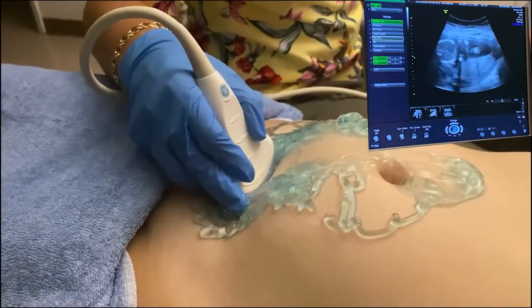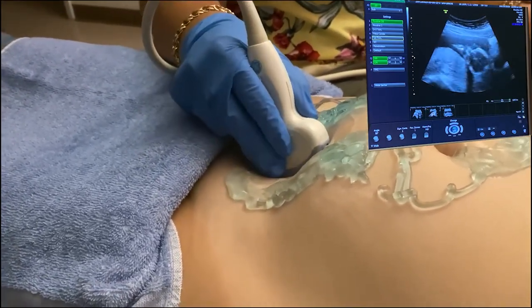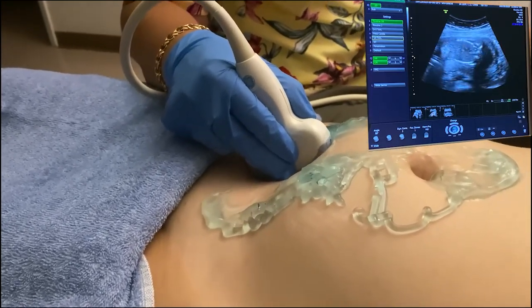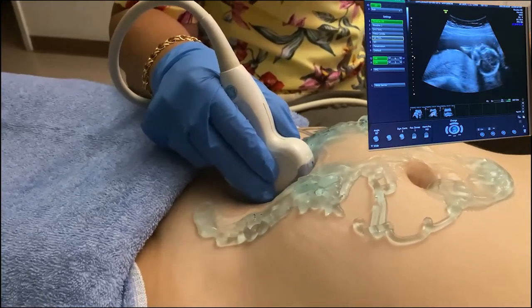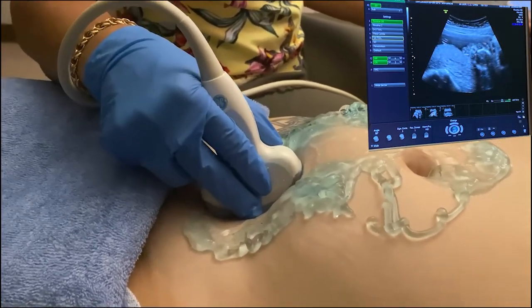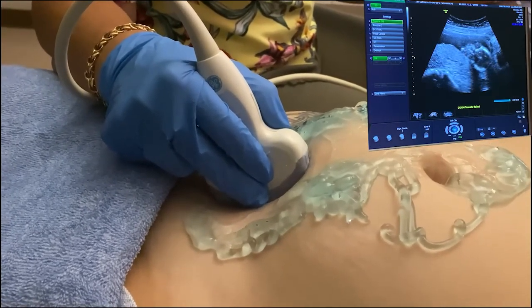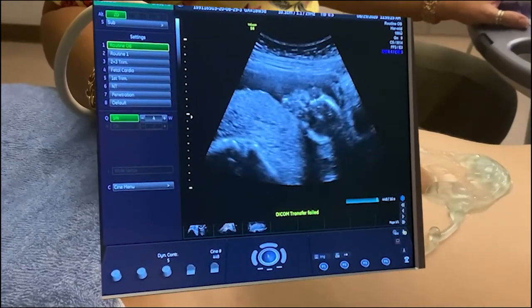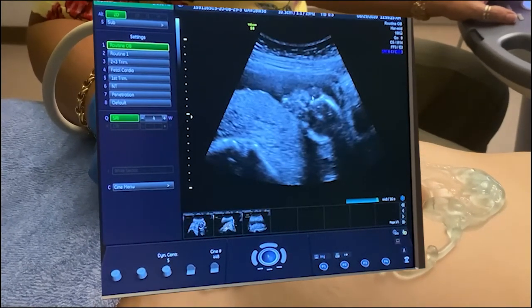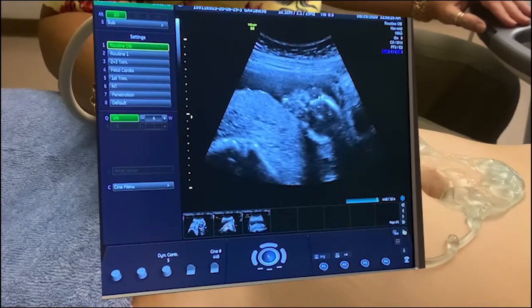And there we go. Now, one of the most, if not the most important thing to do when you are scanning your patient, your fetus, is to determine situs. So this baby's head is down. If I am 90 degrees, there's both orbits. And as we can see, within the orbits of this fetus, we see these two little round, beautiful, look like bubbles.